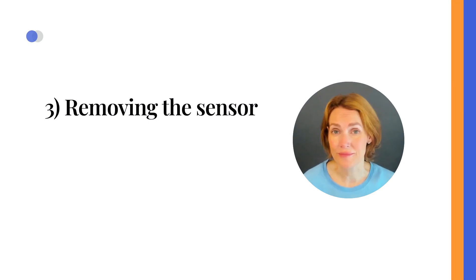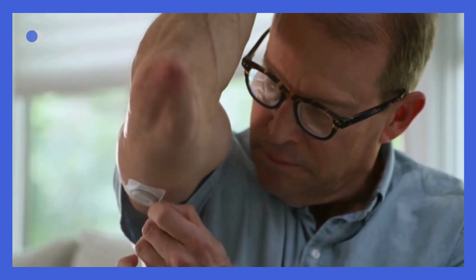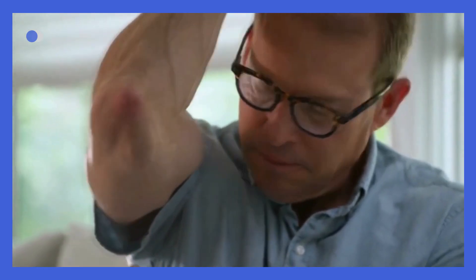Removing the sensor. When it's time to remove the sensor, carefully peel off the patch like a bandage. You can use body or baby oil to help you with the removal.